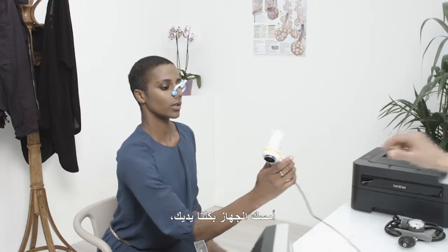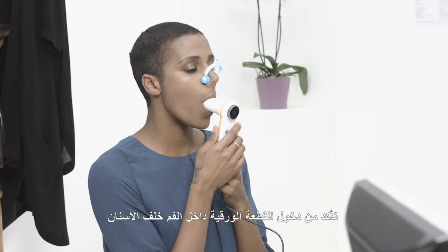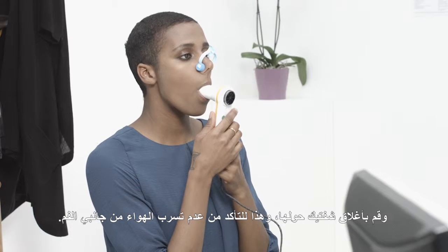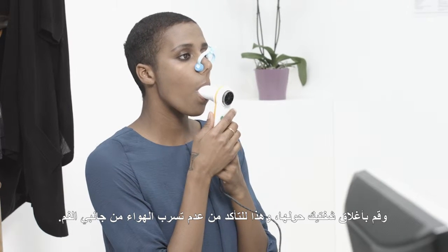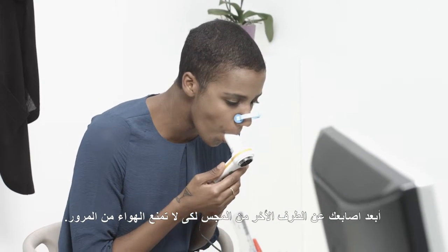Hold the spirometer with both hands. Make sure your mouthpiece is inserted well into your mouth beyond the teeth, and seal your lips around it, so to ensure that air cannot escape from the sides of your mouth. Keep your fingers away from the other end of the turbine so that you do not block the air.